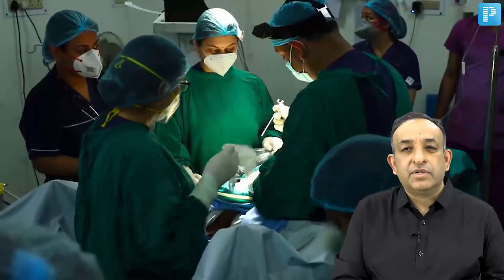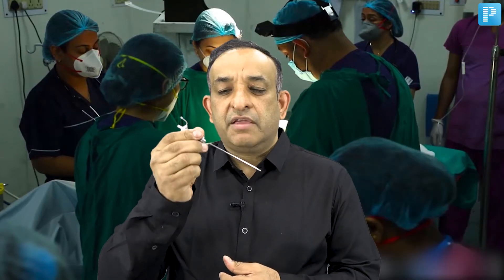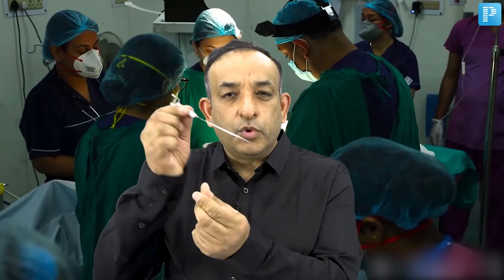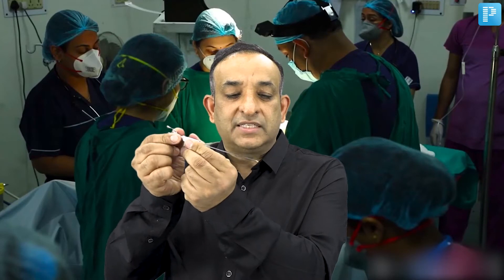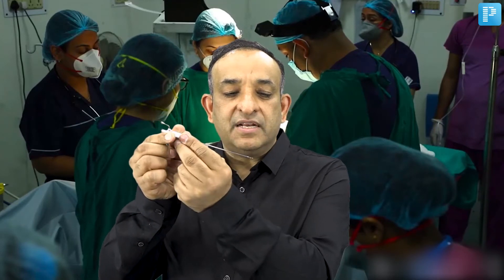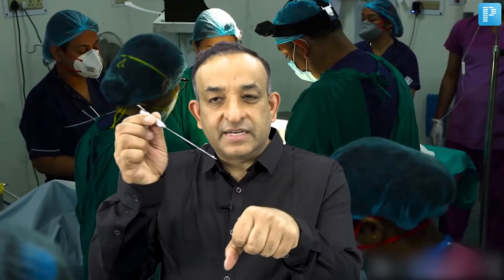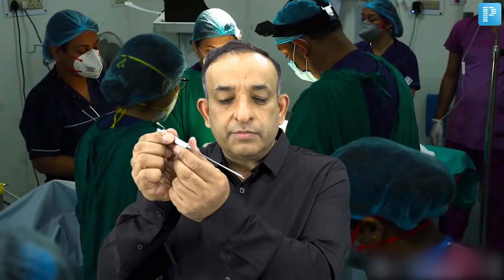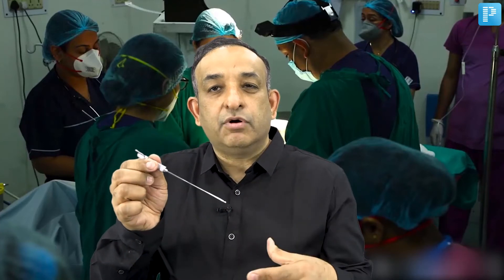I am holding the Veress needle in a dart-holding fashion, because that allows the spring action of the Veress needle to happen when going through the abdominal wall. The Veress needle has two parts: an outer sharp bevel end and an inner blunt stilette. When going through the abdomen, the blunt stilette gets retracted and the sharp bevel penetrates. Once through, the blunt end comes back to protect against injury to organs like the bowel or mesenteric blood vessels.